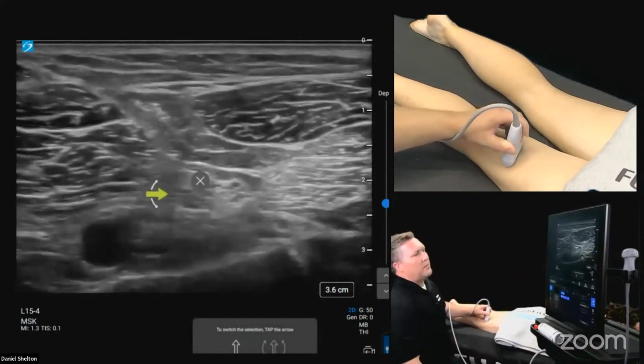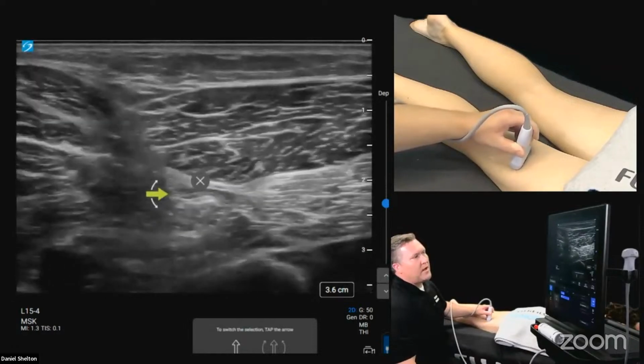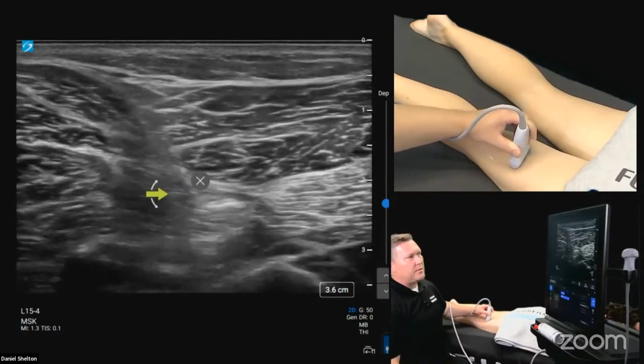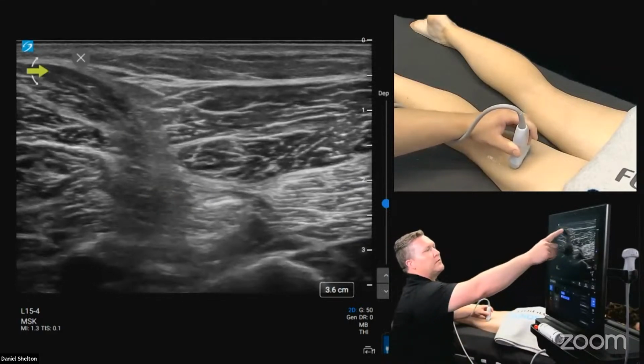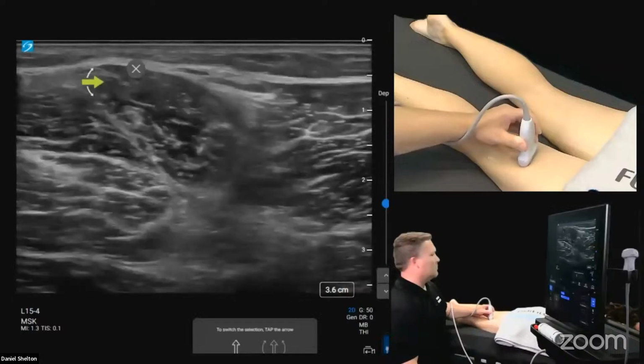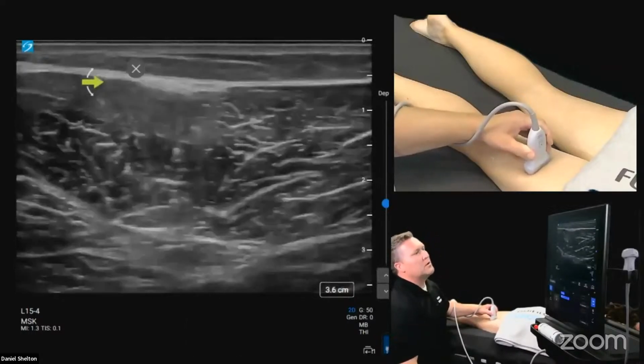So the traditional way to do it would be to go find your sciatic right here. And the problem is with a lot of sciatic scanning, I see people troubleshooting. See this muscle here? We've got this big old gracilis, maybe gracilis.